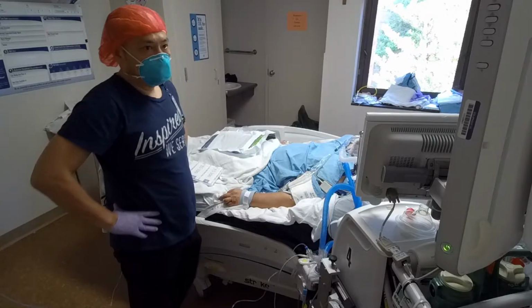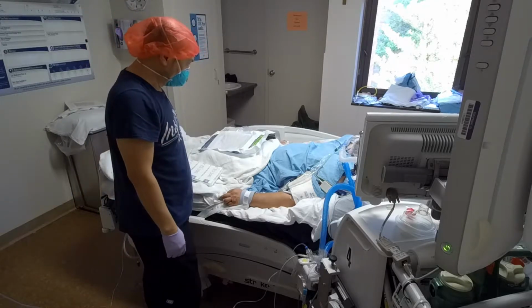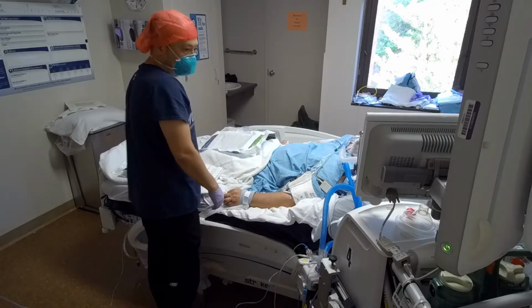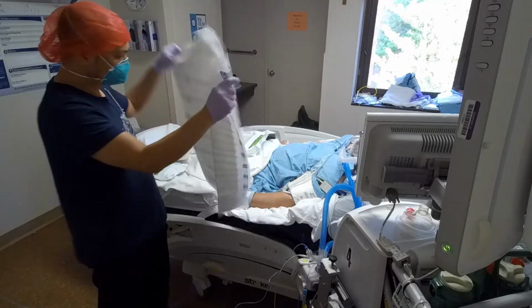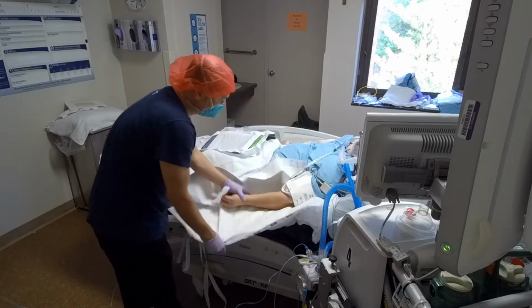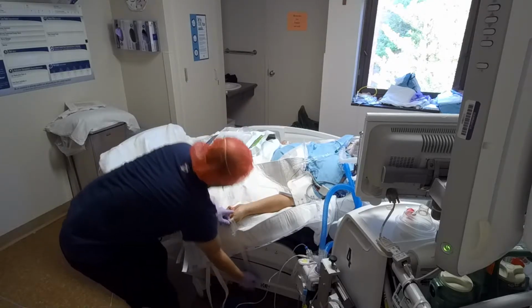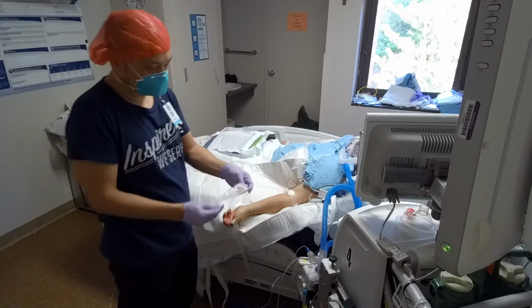We're going to put in an A-line right now. Just remember to have a mask on and a cap on. If you have an assistant, they should have on a cap. Anybody in the room should have on a cap, okay? So first thing you do, get a little pad. Get it underneath, so it won't make a mess. Kind of tape it off the arm, onto the bed. Keep your arm stable.